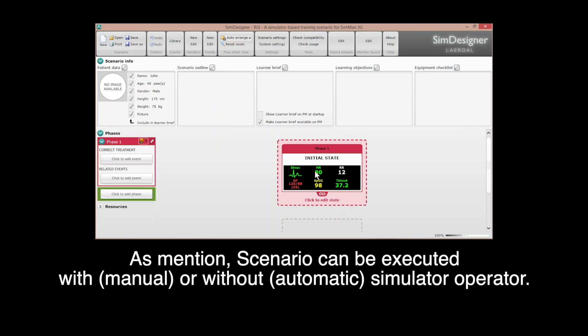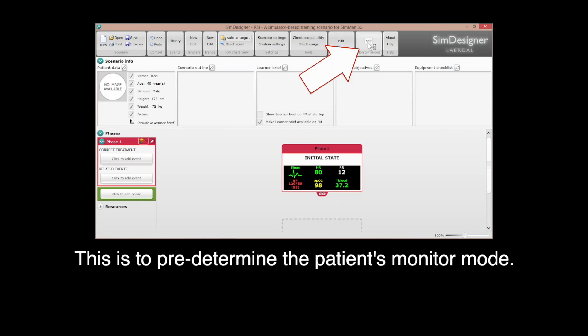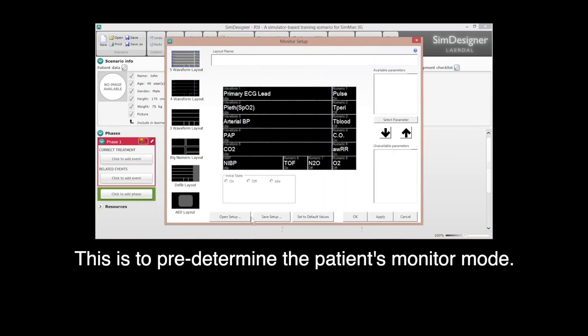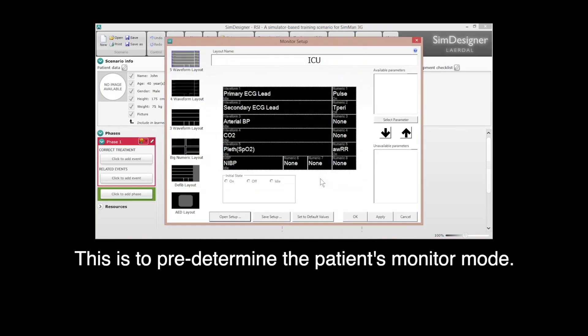As mentioned, scenario can be executed with or without simulator operator. But this video focuses on manual execution, which means operator's inputs are required in simulation training.